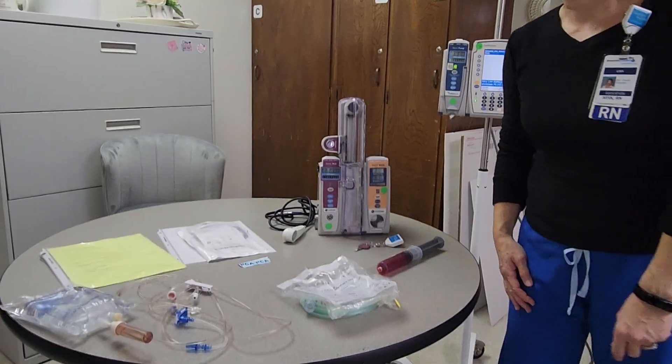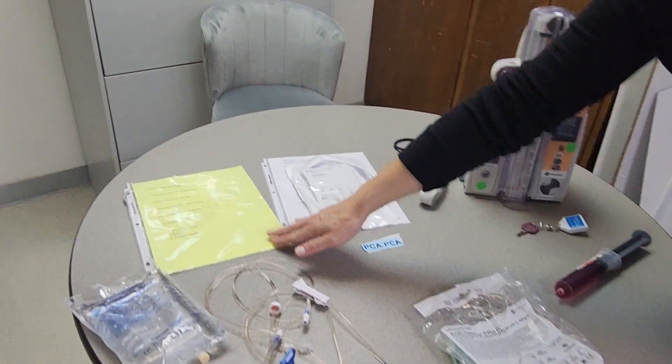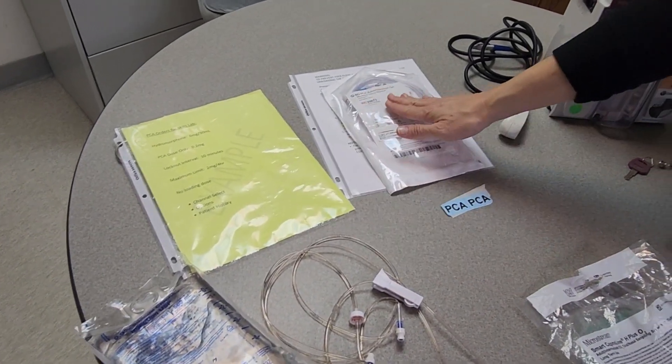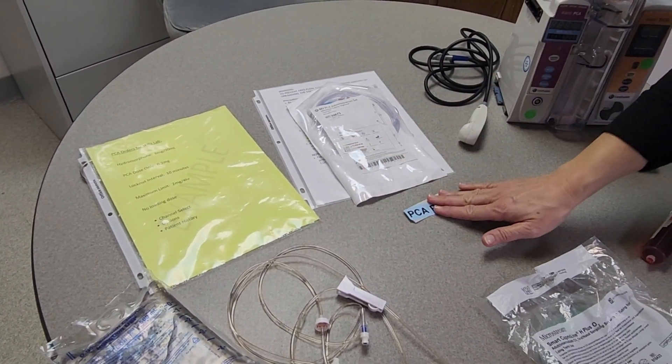We're going to review how to set up a PCA. The first thing you're going to need are your physician orders. You will need a second nurse, as this is a high alert medication. You'll also need your PCA administration set as well as stickers for that.